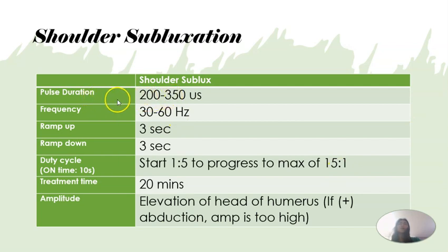Pulse duration. So that we won't have difficulty during the face-to-face, the machine that you ordered uses different terms. It doesn't say pulse duration there, it's pulse width. For the frequency, what's labeled on the machine is pulse rate. Sometimes it's called this, sometimes another. Look at the unit beside the number, whether microseconds or hertz.